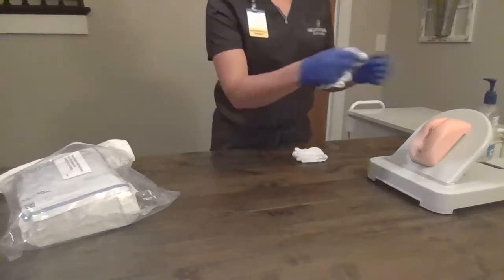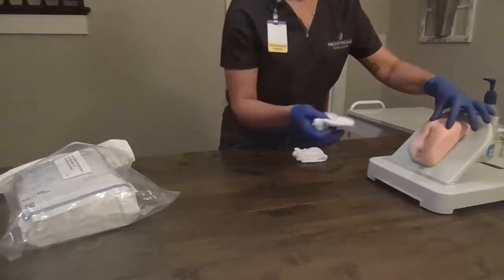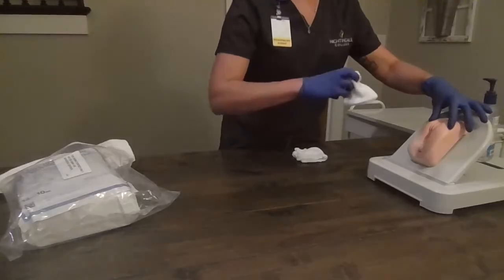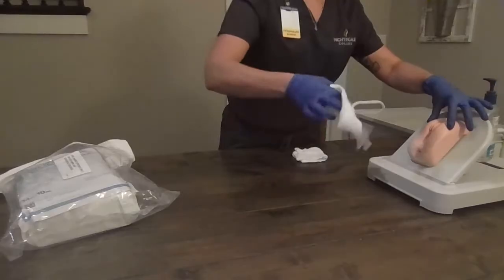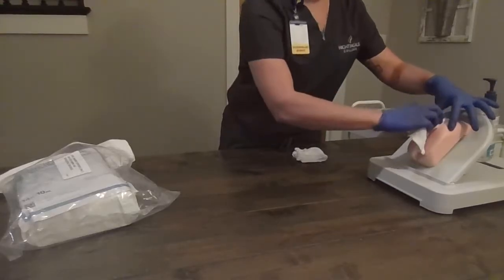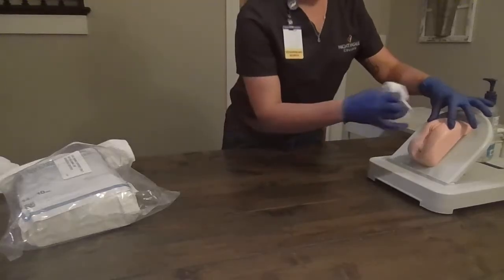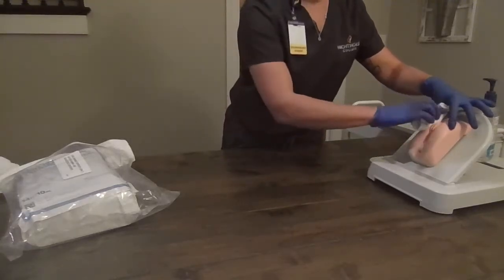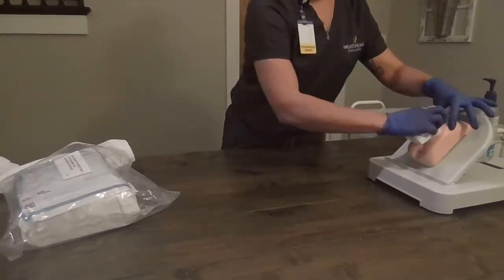Ms. Smith, we're going to uncover your blanket. You're going to feel my hand touching. We're going to wash anterior to posterior — far side, near side, and then anterior-posterior right down the meatus. We're going to dry it the same way: anterior-posterior, far side, near side, and right down the middle.